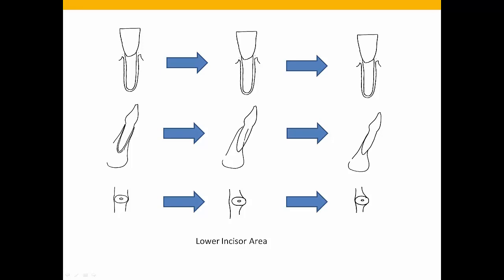But from the sagittal view, if you go from the left to the right, you see that we have the tooth centered within the alveolar bone. We have the orthodontic force which creates the orthodontic boundary violation, and then you get an adaptive resorption of the lingual bone to adapt tightly to the root of the tooth. This adaptive resorption seems to be most relevant in the anterior regions.